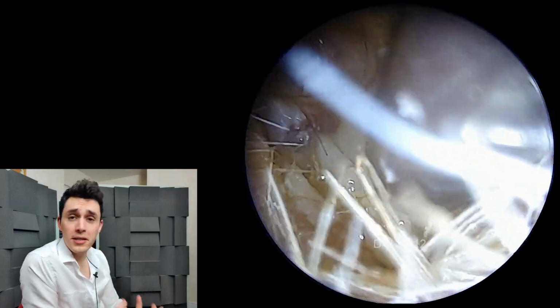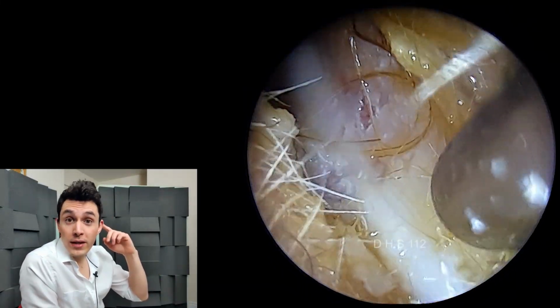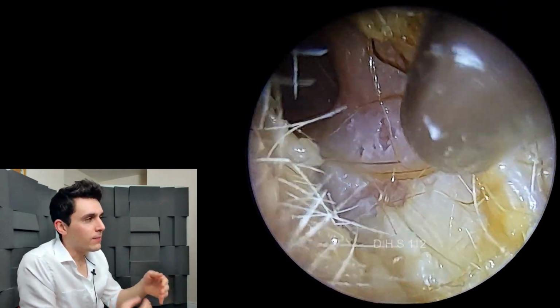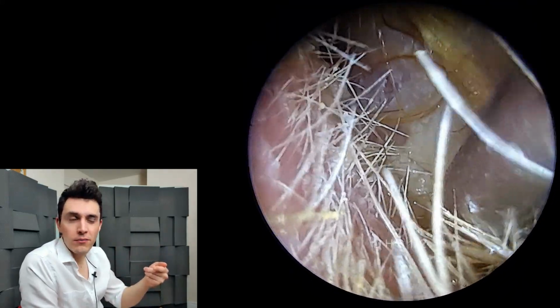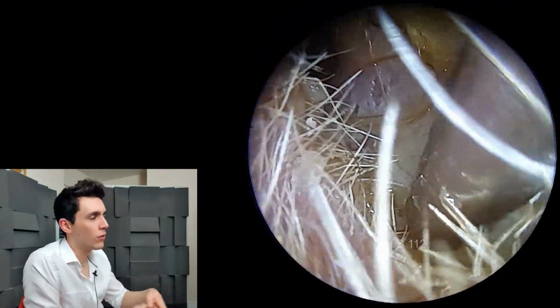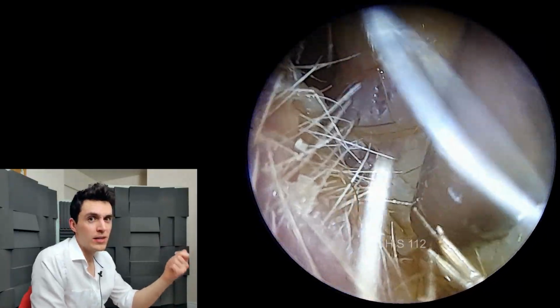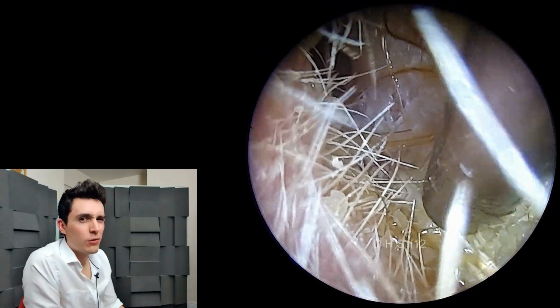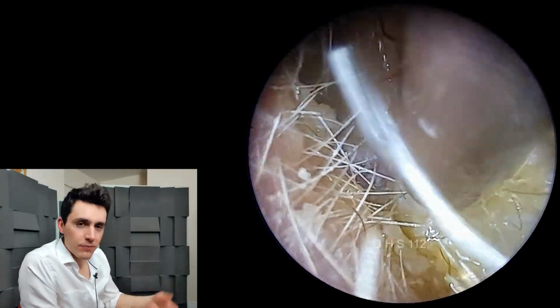Now when an audiologist hears that, we usually suspect wax, because the sound from the hearing aid that's delivered to the ear canal, if there's any debris in the way, will bounce off the debris and leak out of the ear canal back into the microphone, just like when you're at karaoke or a concert and something's turned up too high or the microphone's too close to the speaker, you get that horrible ear-splitting, ringing, whistling. That's what feedback is like. So immediately I'm thinking wax, so I'm going, yep, fine, no problem.